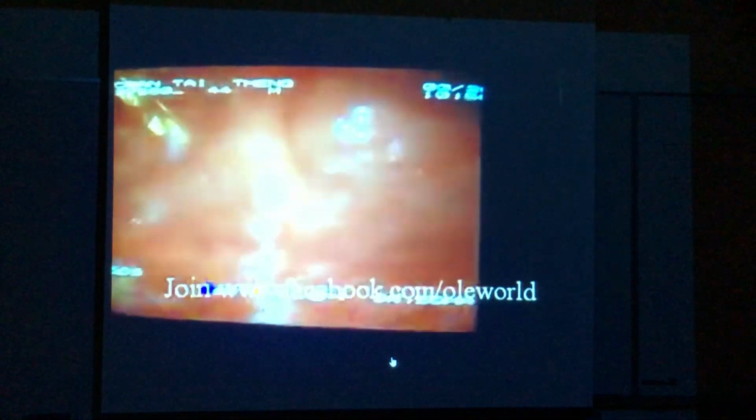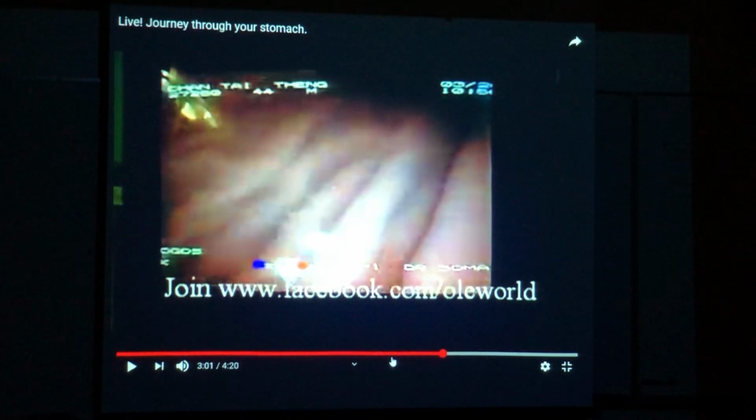Okay. They are coming out now. Still going backwards. Now it's in the body of the stomach. Those are called the longitudinal folds of the stomach, the rugae. They look like long little pleats and allow for the expansion of the stomach. Coming out slowly. Coming out. Now I'm at the cardiac junction. That's the esophagus-stomach region, your cardiac sphincter or esophageal sphincter.